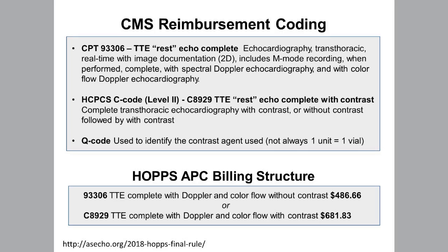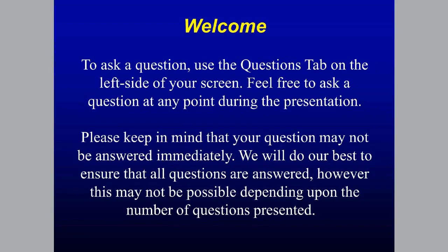But if you're looking to get a nice steady state, like for perfusion, you want a nice continuous infusion, whereas when you're doing boluses, you tend to get a peak and a valley, a peak and a valley. So I would use them for different reasons. But if you're just talking about doing it for LVO in your own institution, I would recommend testing a couple of different ways to see what works best for your whole setup and everything you have in your institution. Yeah, I agree completely with that.